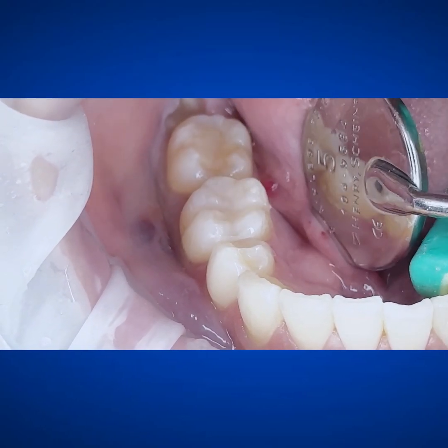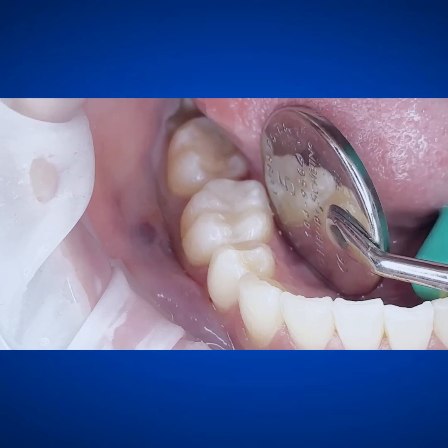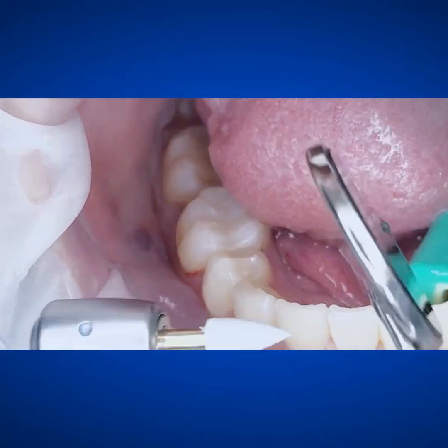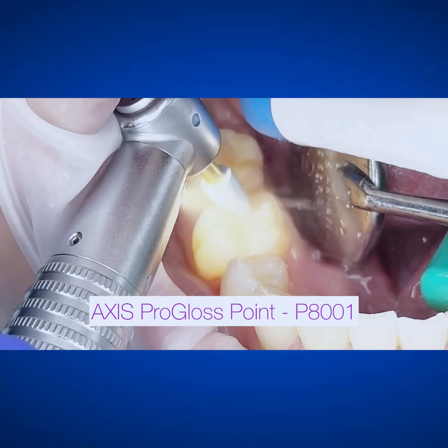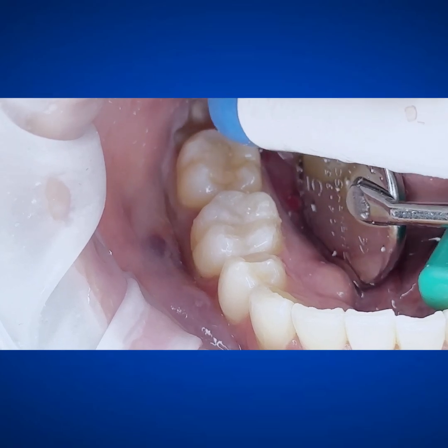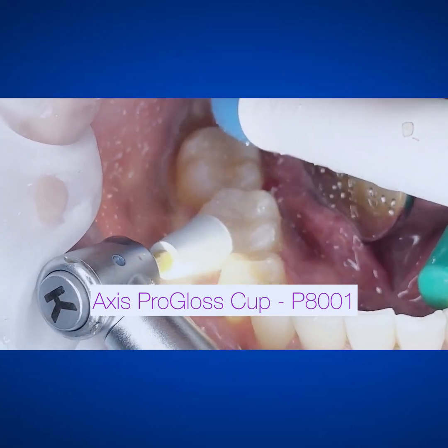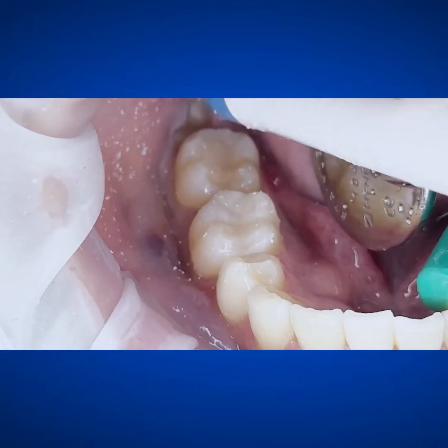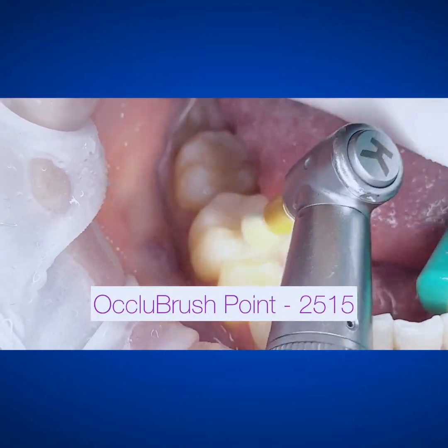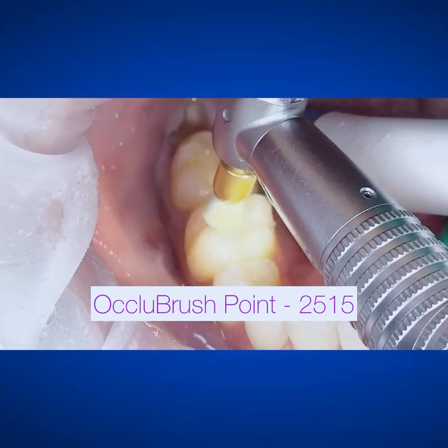Then we'll get to our polishing. I have a couple different things that I use. Use whatever you're feeling comfortable with, but I recommend going in there with the cup and the point. We've got the Progloss point — it's by Axis, a Kerr product. It's really good, kind of like an in-between step, like when you go over with your brownie or something like that. Then get those cups because they're really good at getting interproximal. Once you've gone through that, get in there with that occlu brush point — it really gets that high shine and just makes everything lovely.